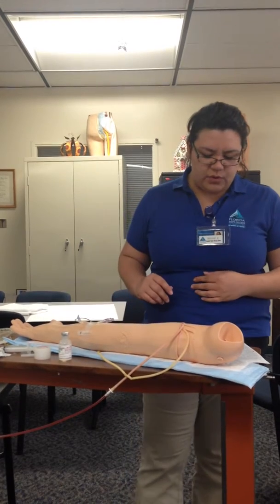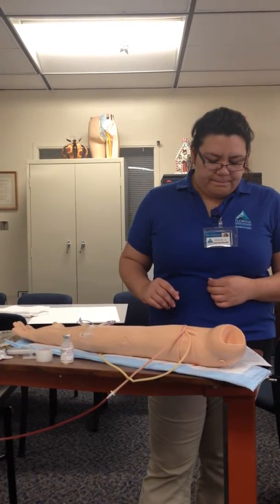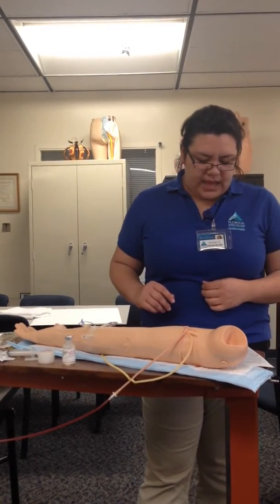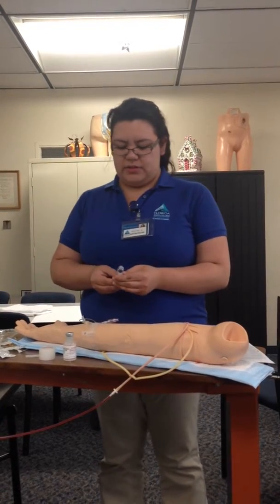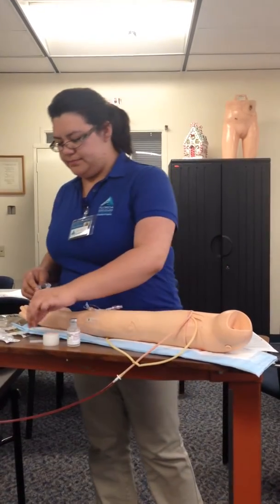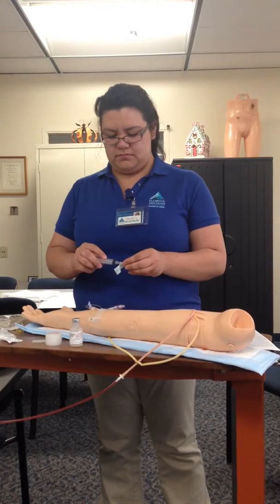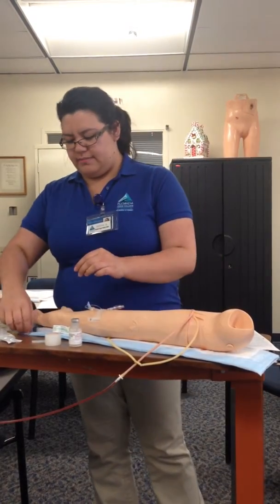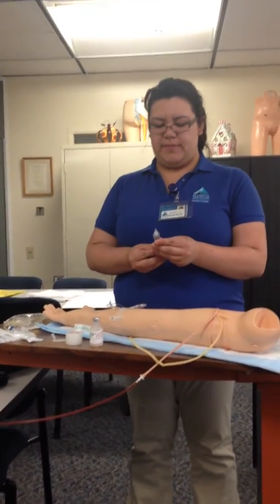So at this point I would add my medication to my bag. I'm going to draw up 500 milligrams. First I would wash my hands and draw up 500 milligrams of my medication.